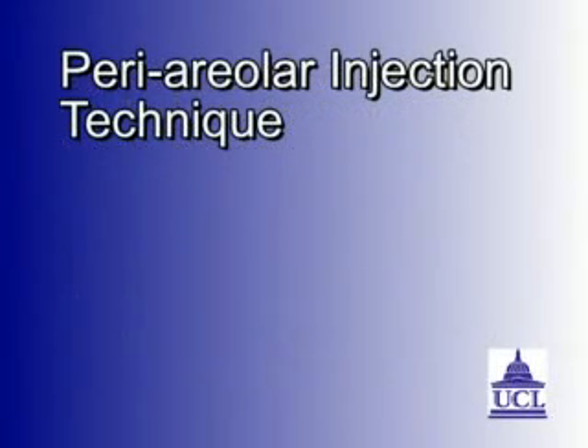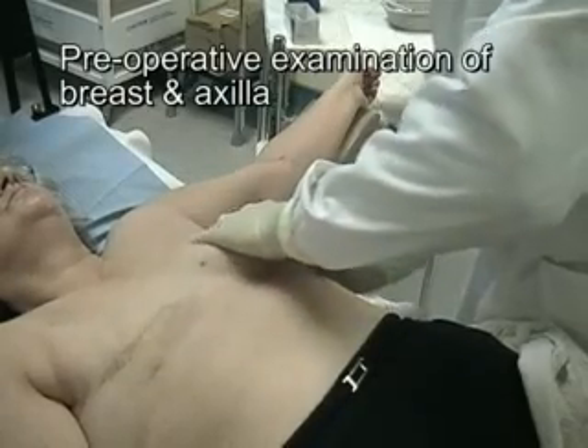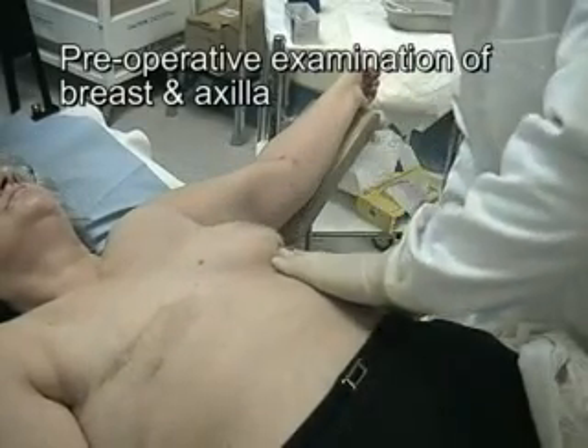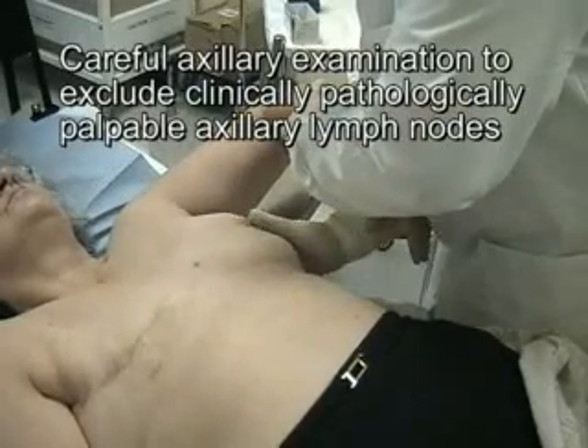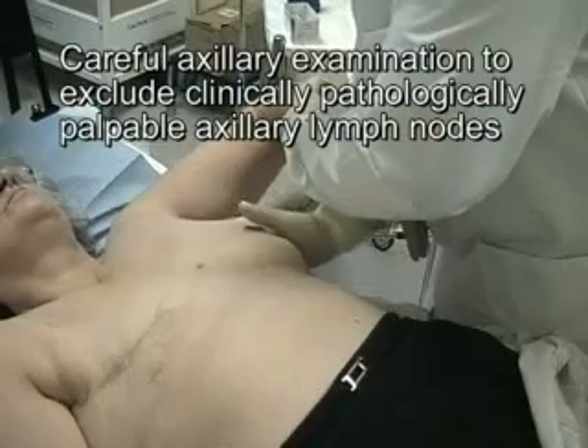We demonstrate periareolar injection of radiocolloids for sentinel node biopsy in a patient with breast cancer. Palpation prior to injection is important to determine the index quadrant of the tumor and to ensure a clinically negative axilla.